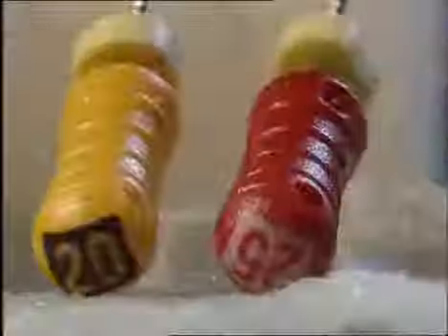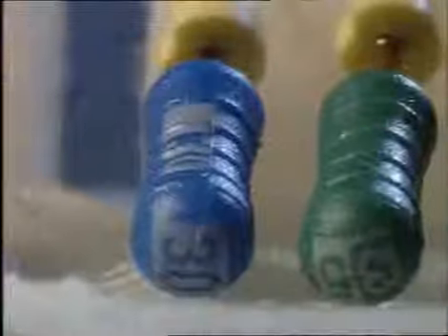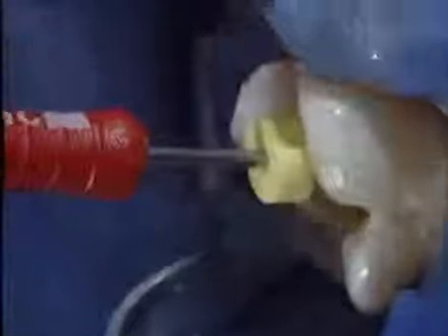After the last recapitulation, the actual size of the foramen is explored with a K file, in this case, a number 20 file. The exact position of the file gets checked electronically and radiographically. The final apical shaping is done in a serial step-back preparation. Serial step-back preparation entails the use of a series of progressively larger instruments that are worked, or stepped back, successively further from the end of the root canal prep.